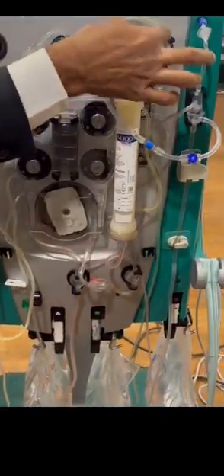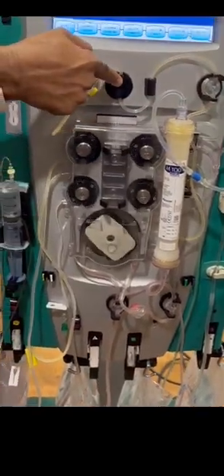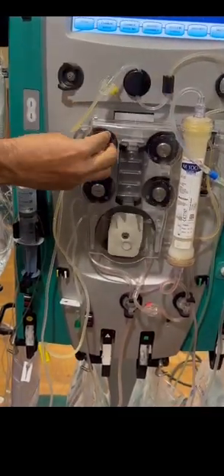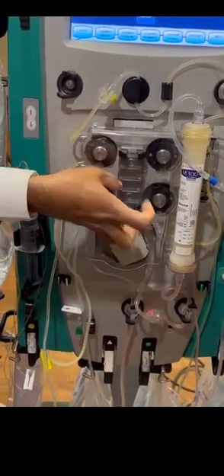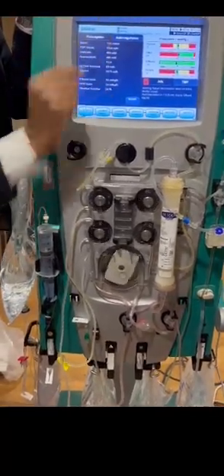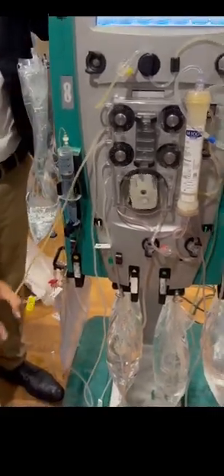Then the blood leak detector. In case of rupture, the blood will escape into this line only. This is the drain. This is the effluent pump. You will have to calculate the effluent pump speed. That I will tell separately, I will come to this. Now this comes to the bag. It completes all the circuit.